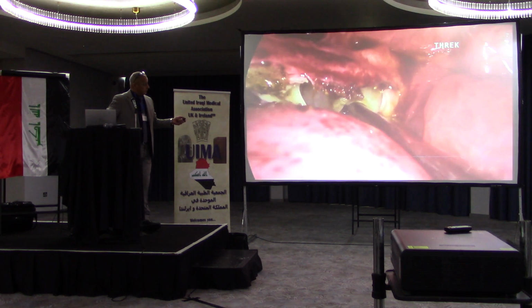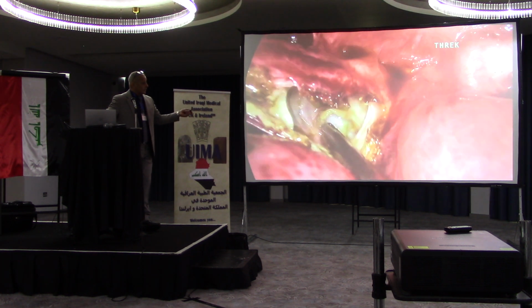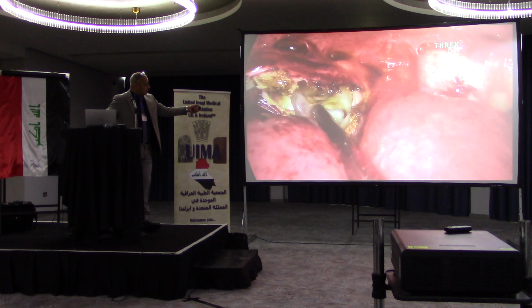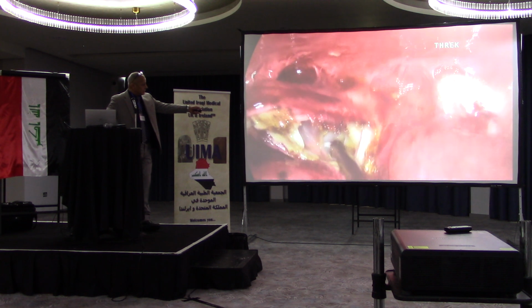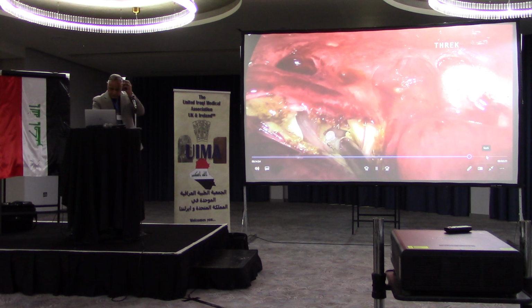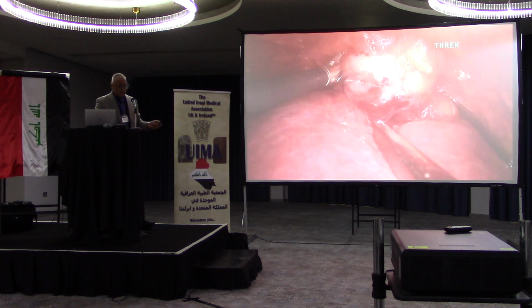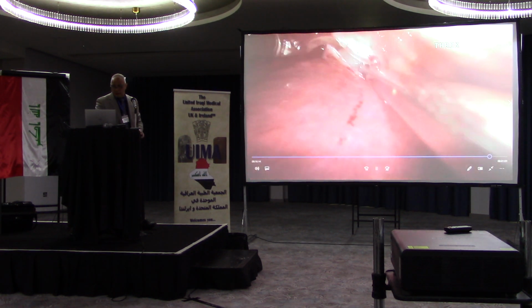Another advantage of laparoscopic surgery is that we can enter inside the cavity and look for the others. The cavity inspection is the most important. This is a septated cyst, and the other cyst is hidden inside. Also, we can withdraw it. The other cyst is dealt with by the same procedure. This one is in contact with the diaphragm and nearby the heart. This is the midline and the diaphragm with the heart above.